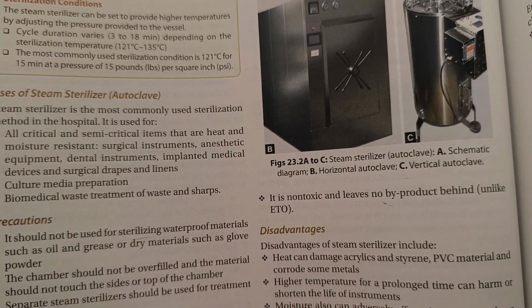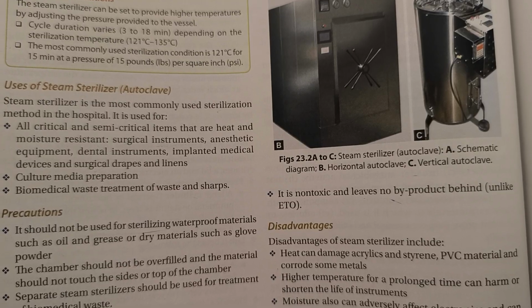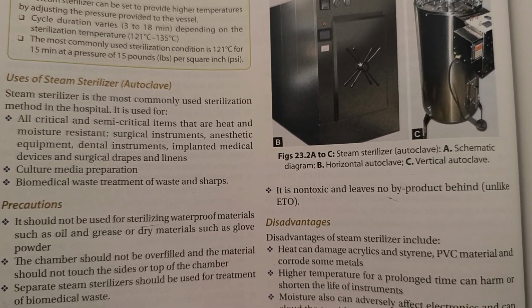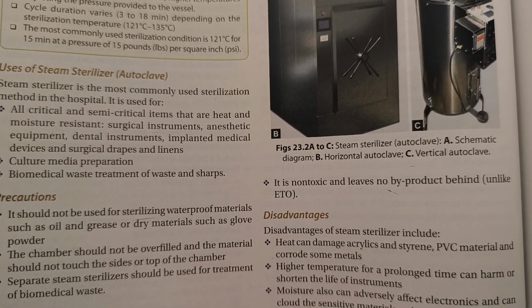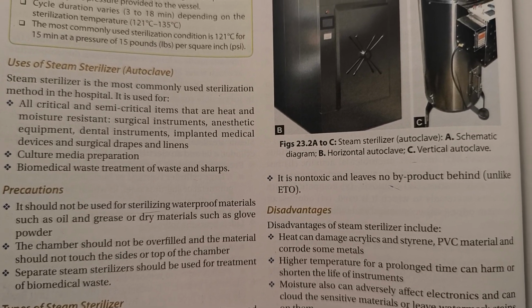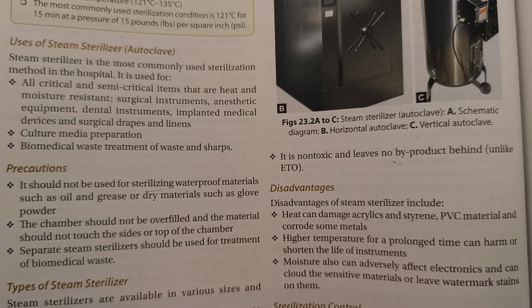Sterilization conditions. Steam sterilizer can be set to provide higher temperatures by adjusting the pressure provided to the vessel. Cycle duration varies from 3 to 18 minutes depending upon the sterilization temperature of 121 degrees Celsius to 135 degrees Celsius.